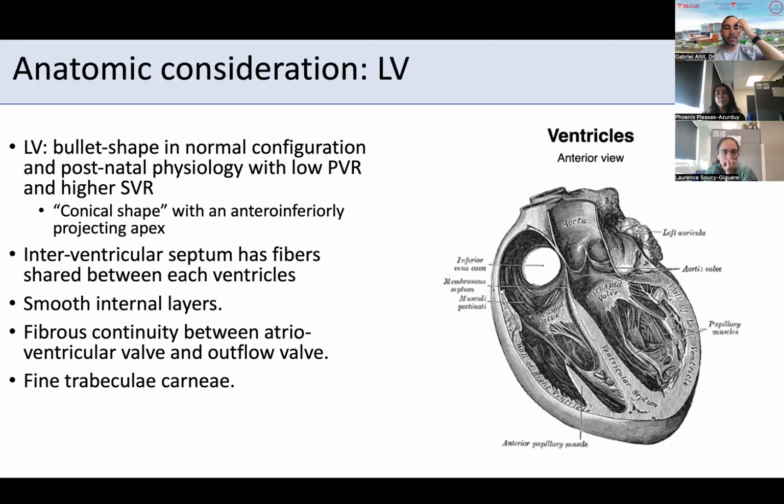That is really why it was named mitral, as it has the same shape. As you can see, the leaflets come into papillary muscles that attach on this part of the wall. On the other side you have a tricuspid valve, which is set a bit more inferiorly.